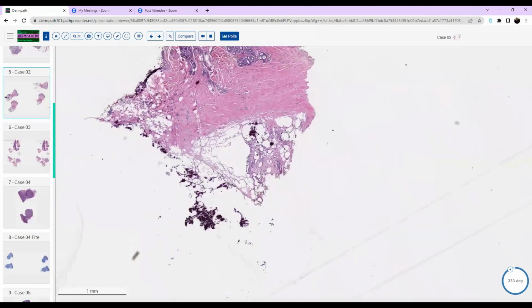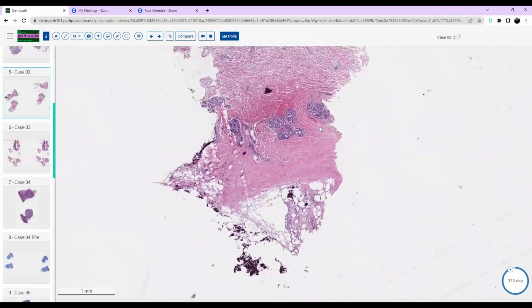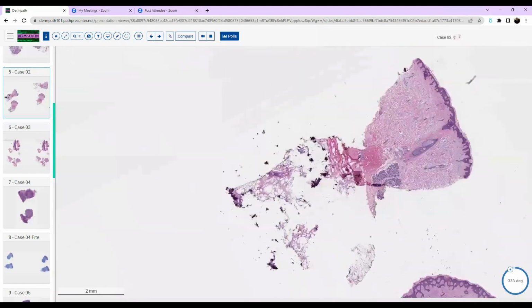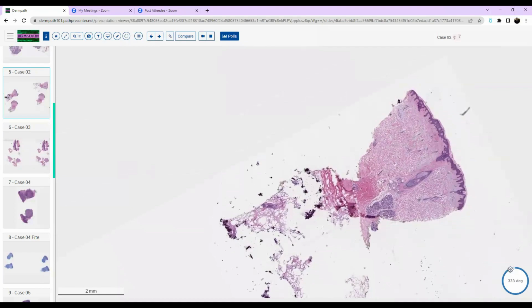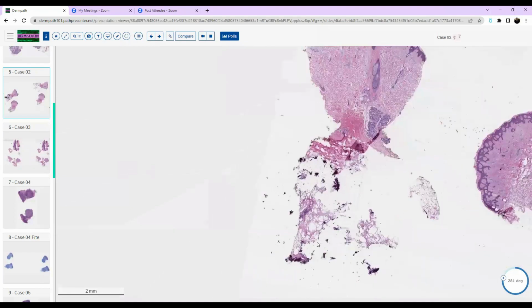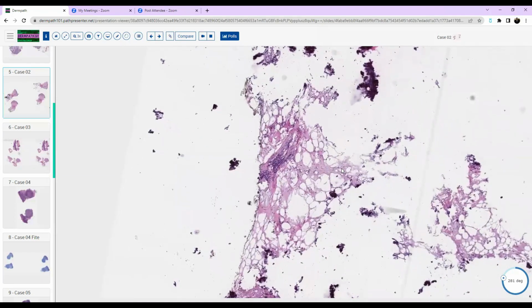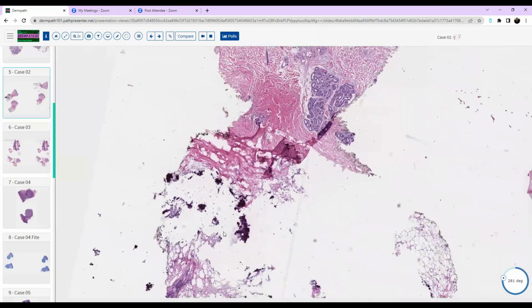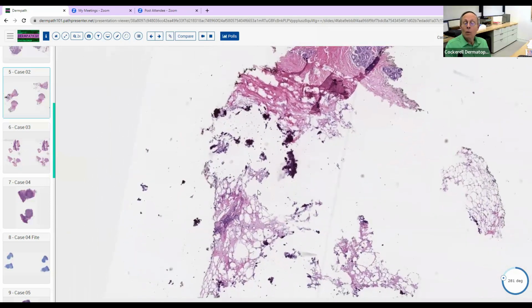Yes. What's your differential diagnosis of that? So I had quite a few things that I was thinking about potentially, and lots of reasons why it wasn't some of these things. Something we could have thought about was calciphylaxis, but we would have normally expected to see that around vessels. Yeah, that's right.